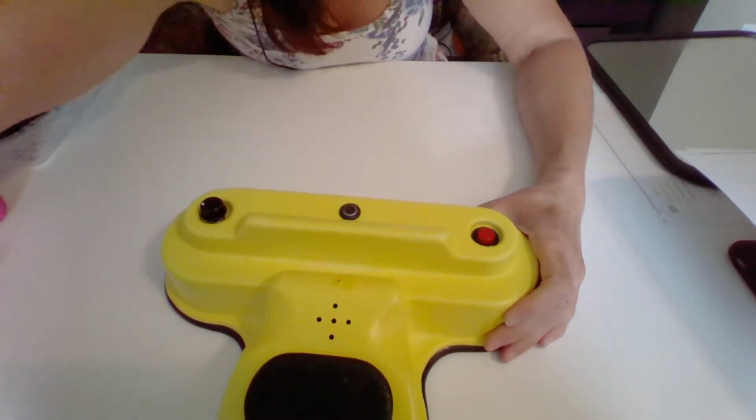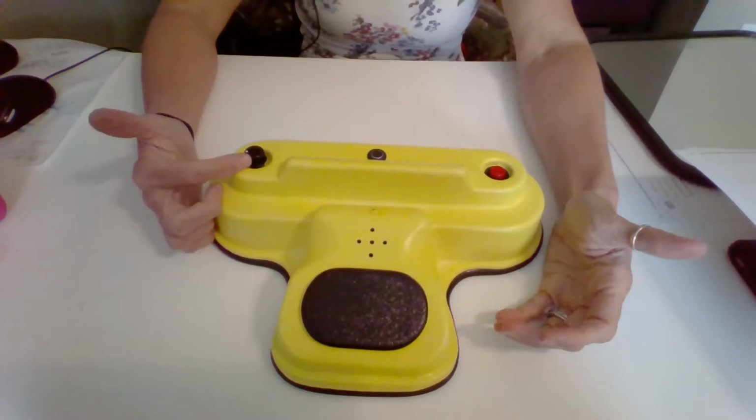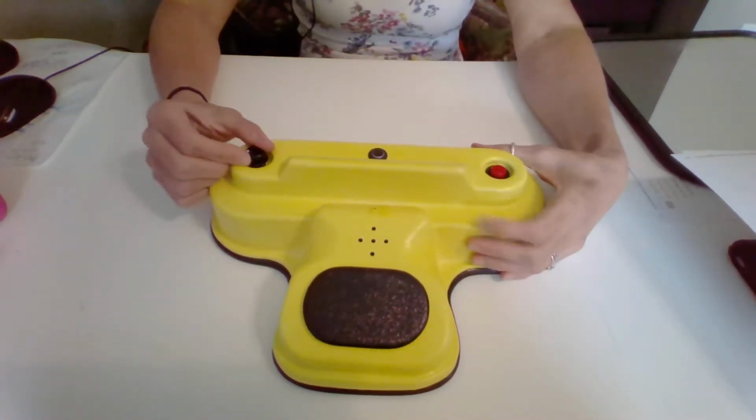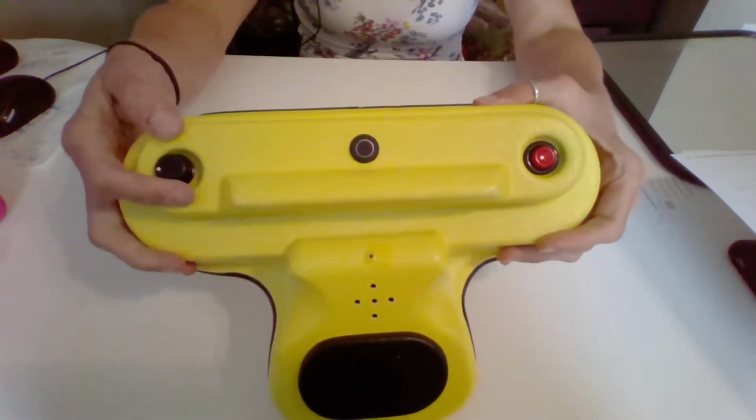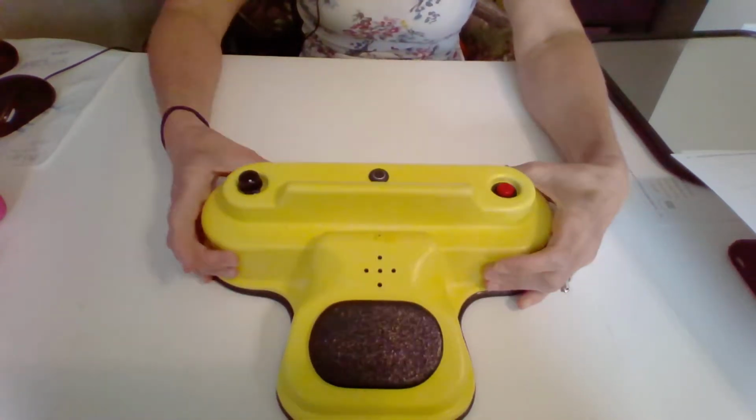So we have basically 3 knobs here. We've got a button, a volume button, and a red button. What you're going to want to do is turn it on first. I'm going to turn this on. Crank that volume. I'm going to crank it all the way up so we can hear it at first, okay?